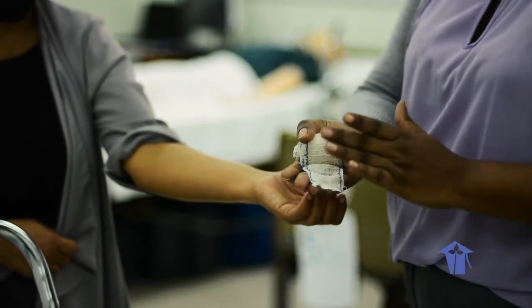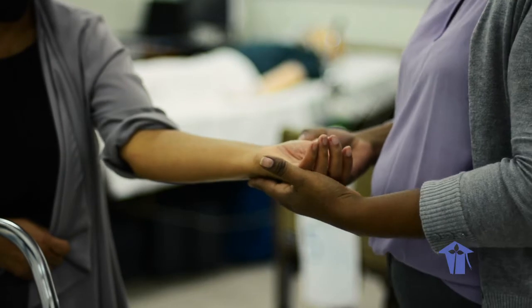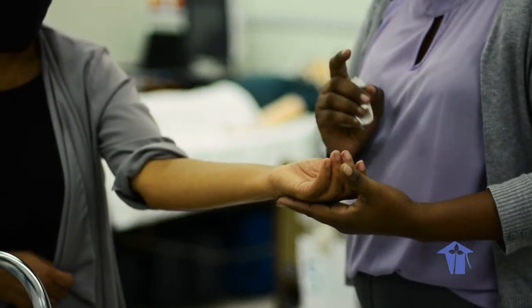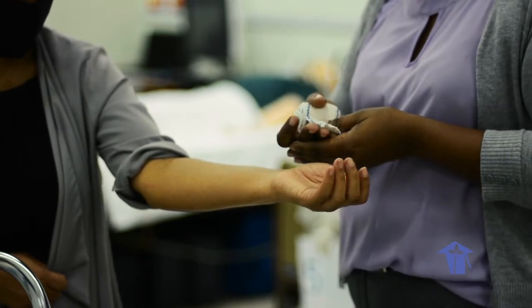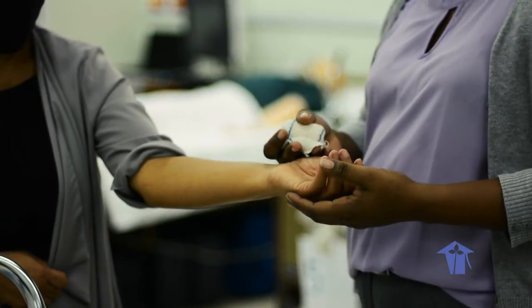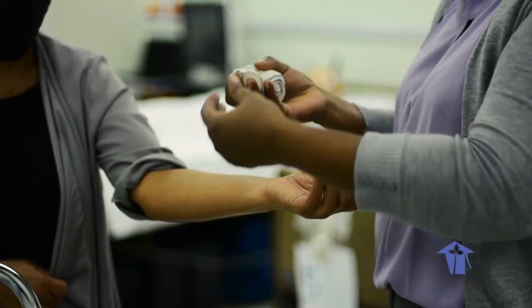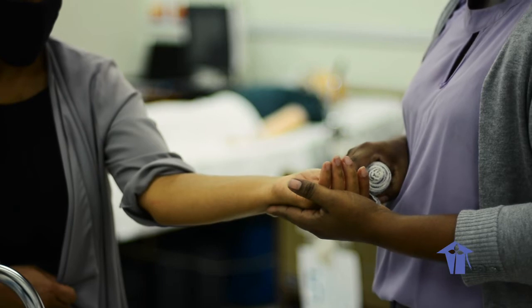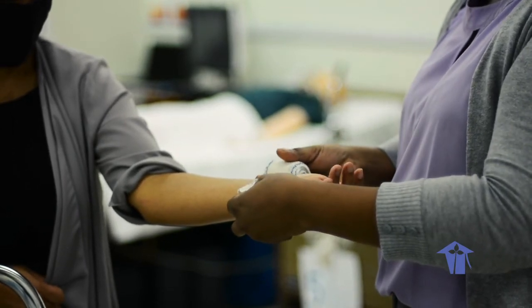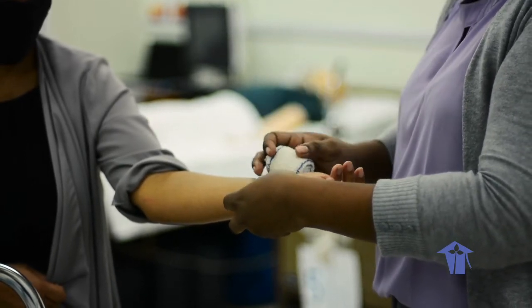The opening of the bandage always faces the ceiling before you start to roll and wrap. You want to inspect the site, ensuring the patient has sensation above and below the part, because a bandage should never constrict or cause further harm. As you start wrapping, ask the patient at intervals if it is too tight. If they indicate it is, you can simply unroll and re-roll a little slacker.